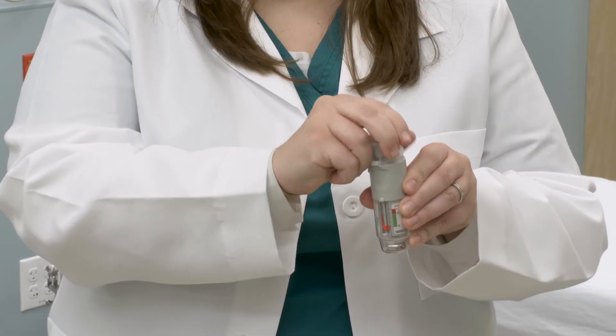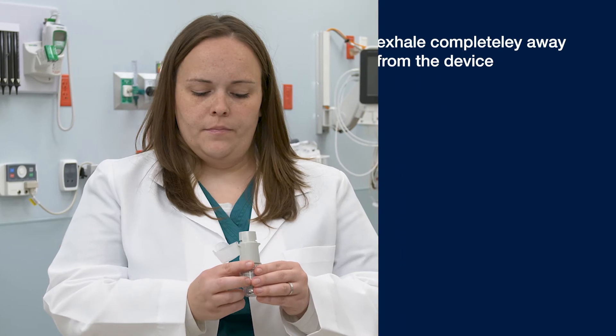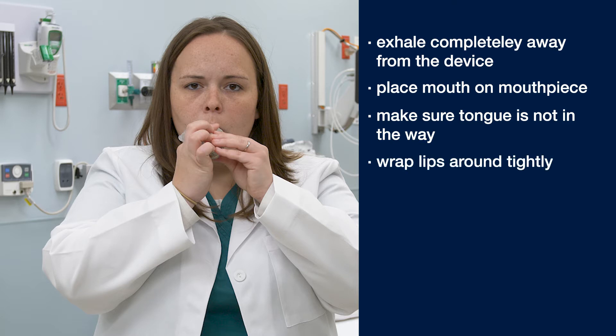You will next remove the cap from the Respimat device. You will want to exhale completely away from the device before putting the mouthpiece in your mouth. You will place this in between your teeth, making sure that your tongue is not in the way and making a good seal on the mouthpiece with your lips.